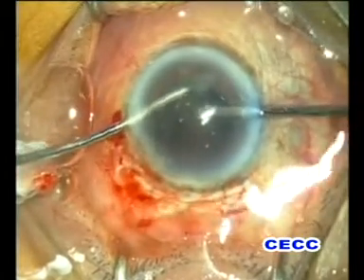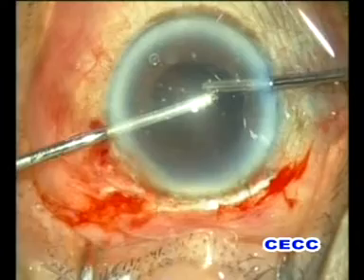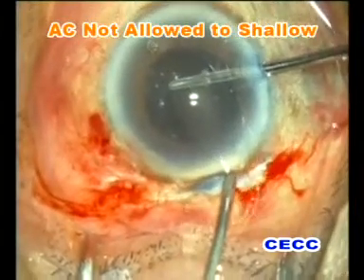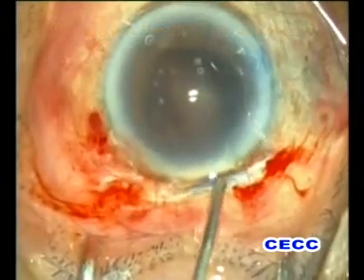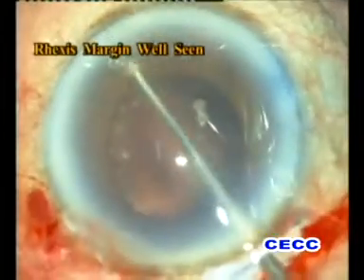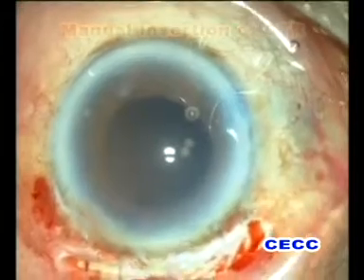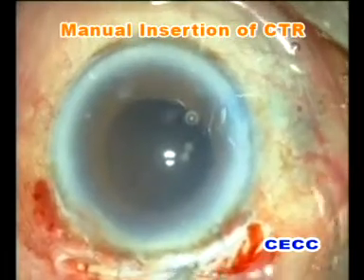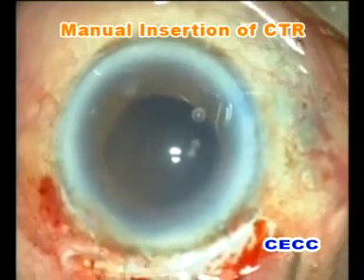Vitrectomy may have to be repeated as and when further vitreous prolapse occurs in the anterior chamber. The anterior chamber should never be allowed to shallow. Viscoelastic is injected before the irrigation handpiece is removed from the anterior chamber.